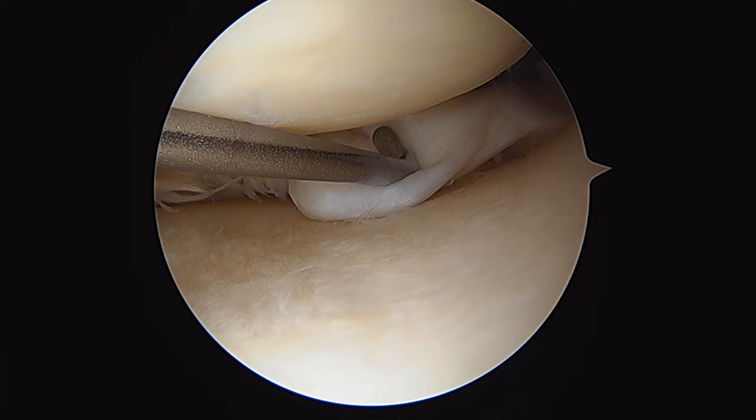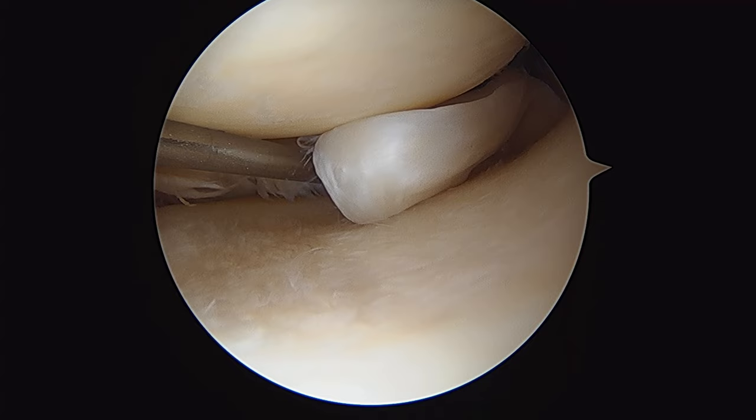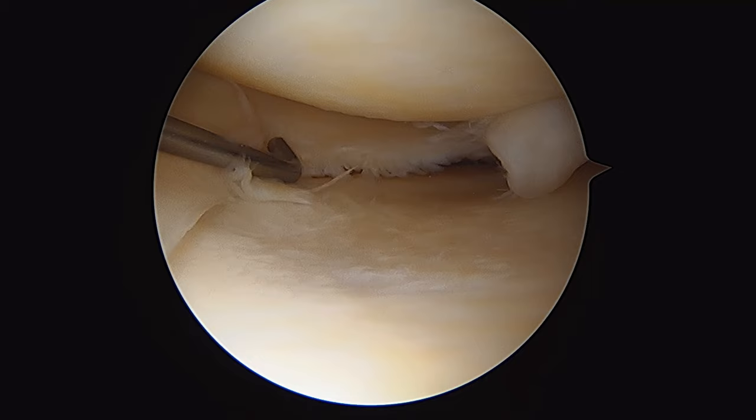This is in the white zone of the medial meniscus, so an attempted repair of this torn tissue is likely to fail. So in cases like this, we're going to do a partial medial meniscectomy and resect this torn tissue, debriding it back down to a stable rim.